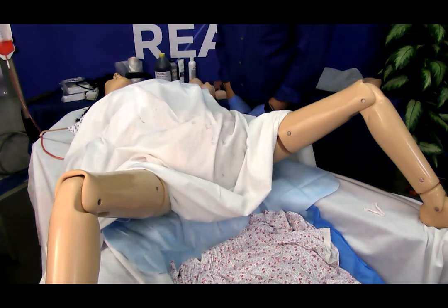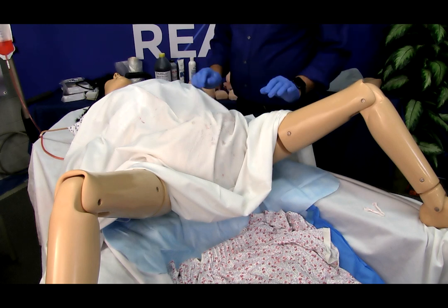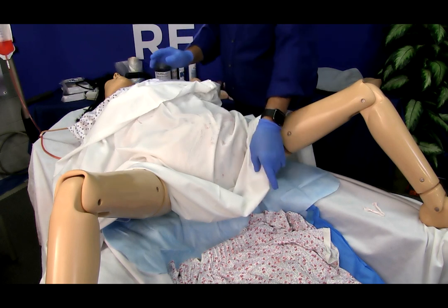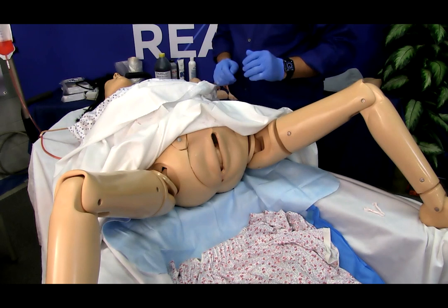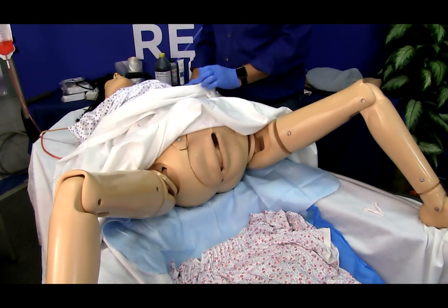To simulate a vaginal delivery, follow the instruction manual for proper steps to set up Lucy. Blood and cold cream may be applied to the fetus to add realism. Be sure to generously lubricate the vagina and fetus for easy removal. And follow all institutional procedures for vaginal deliveries. Now we will demonstrate the vaginal delivery.